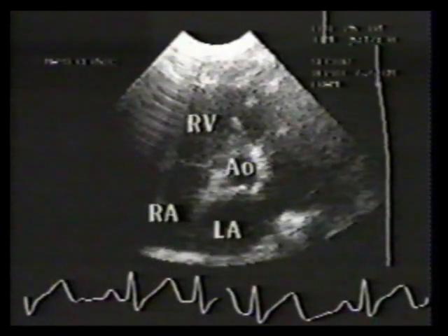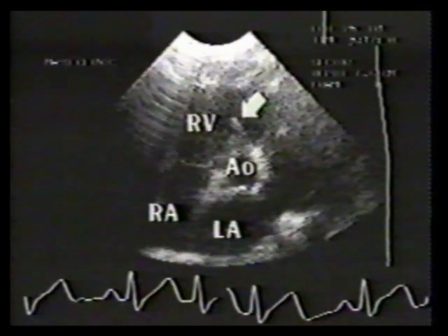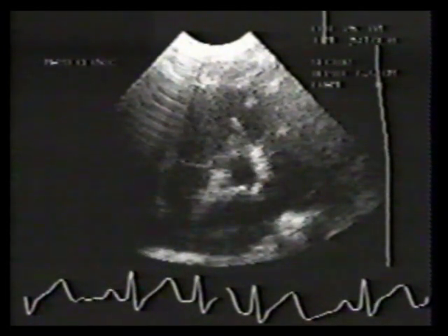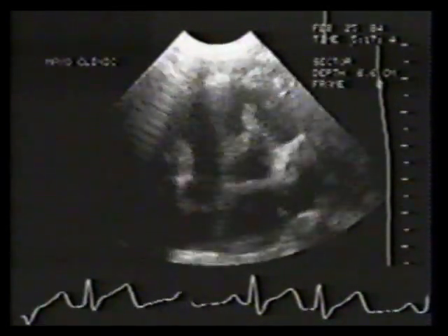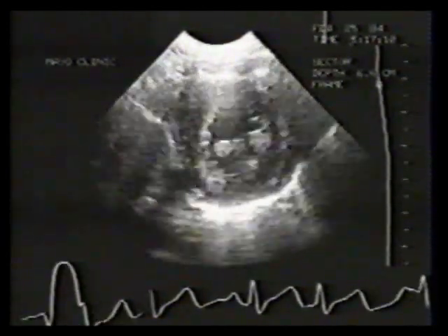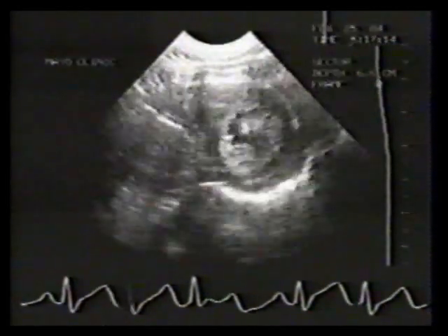This is a short-axis scan at the level of the aortic valve in the same child. Note that there are masses visible in the right ventricular outflow tract. In real time, some of these masses appear to be pedunculated, while others are fixed and sessile, and yet others appear to be embedded in the myocardium. This is a typical spectrum of the benign rhabdomyoma of childhood.